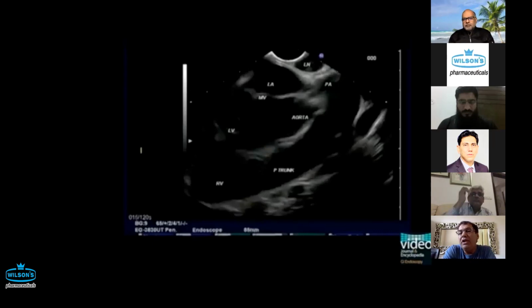And these are really the only two places. There is a third too, but these are the only two places where you can easily approach these lymph nodes if you have to biopsy. Another thing you can do, which I have done all the time, is lung masses which are really close to the esophagus. They are very easy to do FNA through the esophagus or biopsy. I just did one yesterday, and you can see those easily. Even though they are lung-based, when they are attached or very close to the esophagus, you really don't run into any trouble.